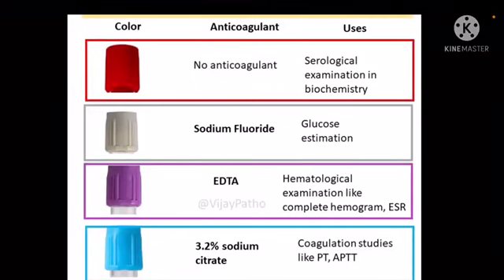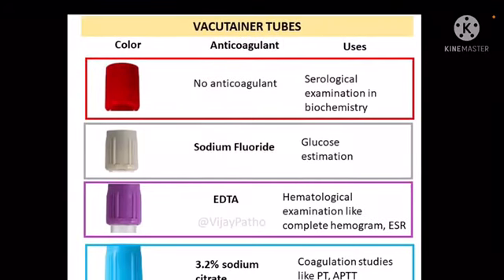Today we are going to discuss the different types of Vacutainer tubes. The Vacutainer tubes have a spray-coated silica and are used for serum determination in chemistry. The samples processed in these tubes may also be used for routine blood donor screening, immunohematology, and diagnostic testing of serum for infectious diseases, and also for checking blood glucose and bone marrow or coagulation studies.